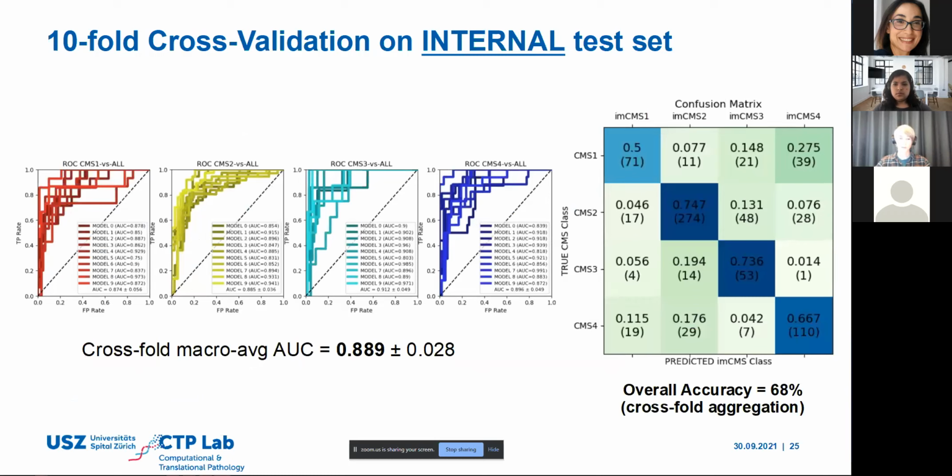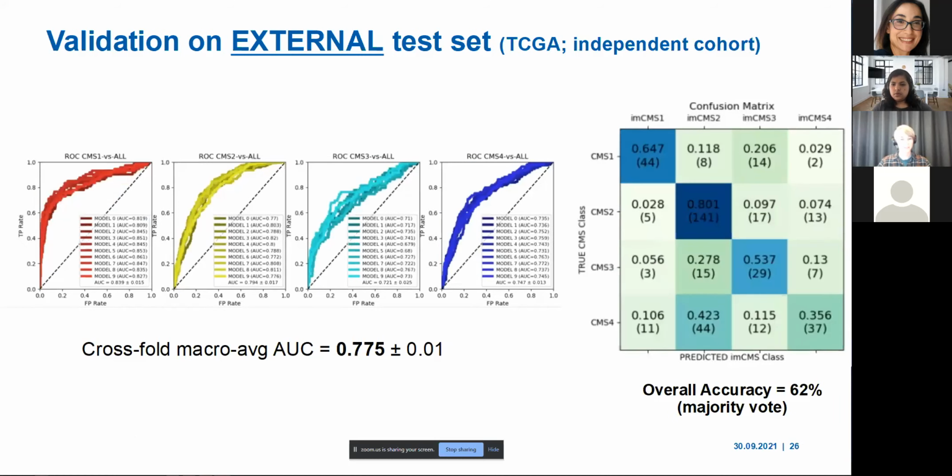So I would like to show you some results of this classification process. We show on a large cohort, by cross-validation, that we could have good scores, showing that it is possible to reasonably distinguish between these patients related to the molecular information, but using only image data. We also validated this on an external multi-cohort dataset, TCGA, to validate that our model can still perform in very different conditions than with the data that was used to train it.